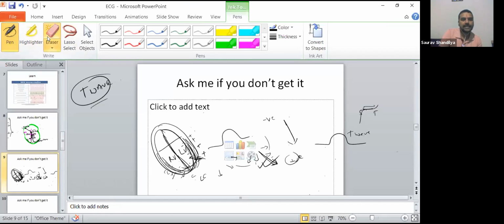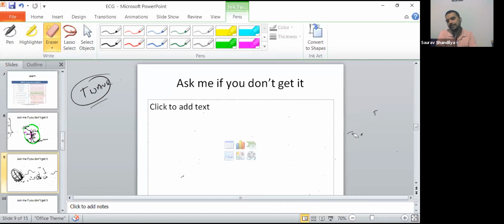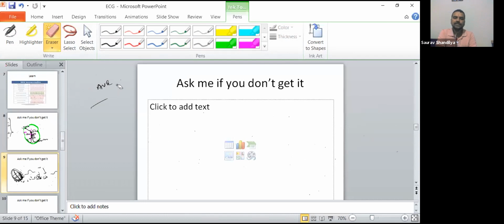Not more than that you have to understand. So all direction is like this. This is enough to understand how everywhere the current getting repolarized, or negative moving to positive, and the direction is almost similar, from negative to positive. So talking about the resultant vector, which is in the alignment of that current, that is how it is showing the positive deflection. I told you the T wave just now, I repeated.